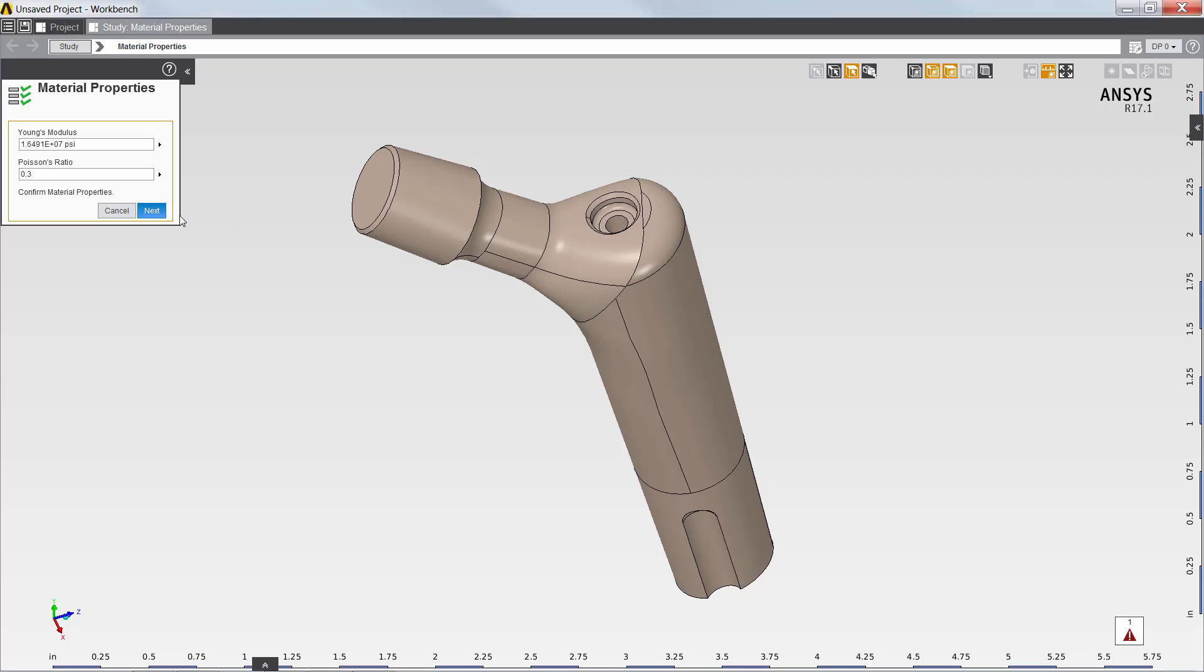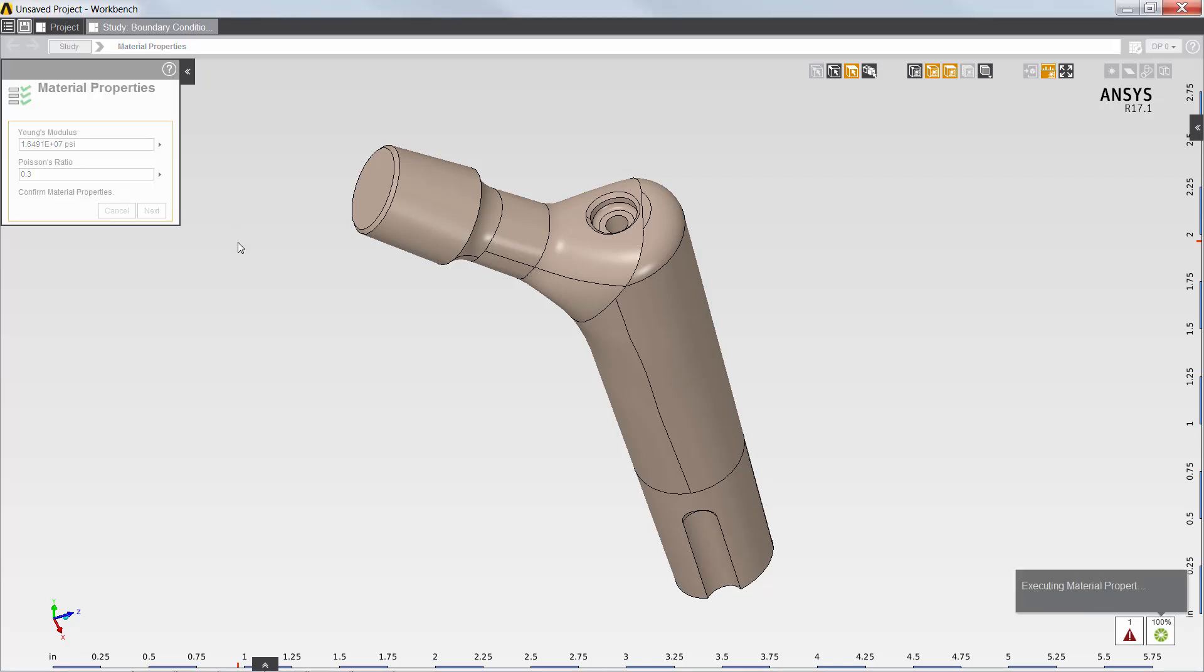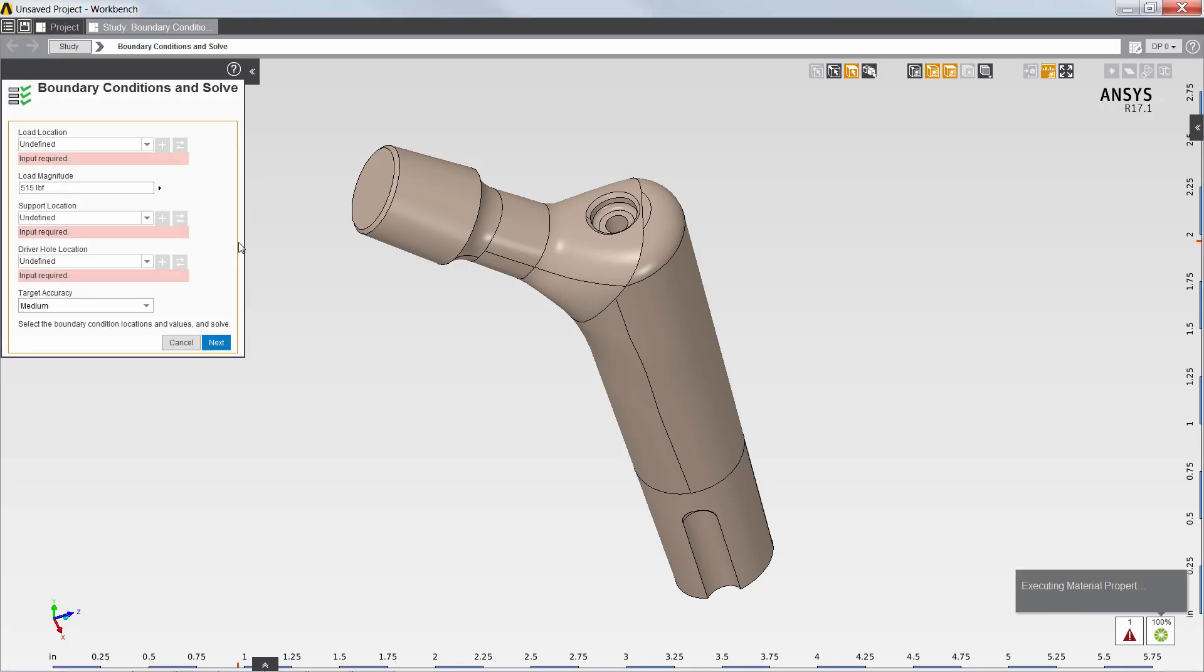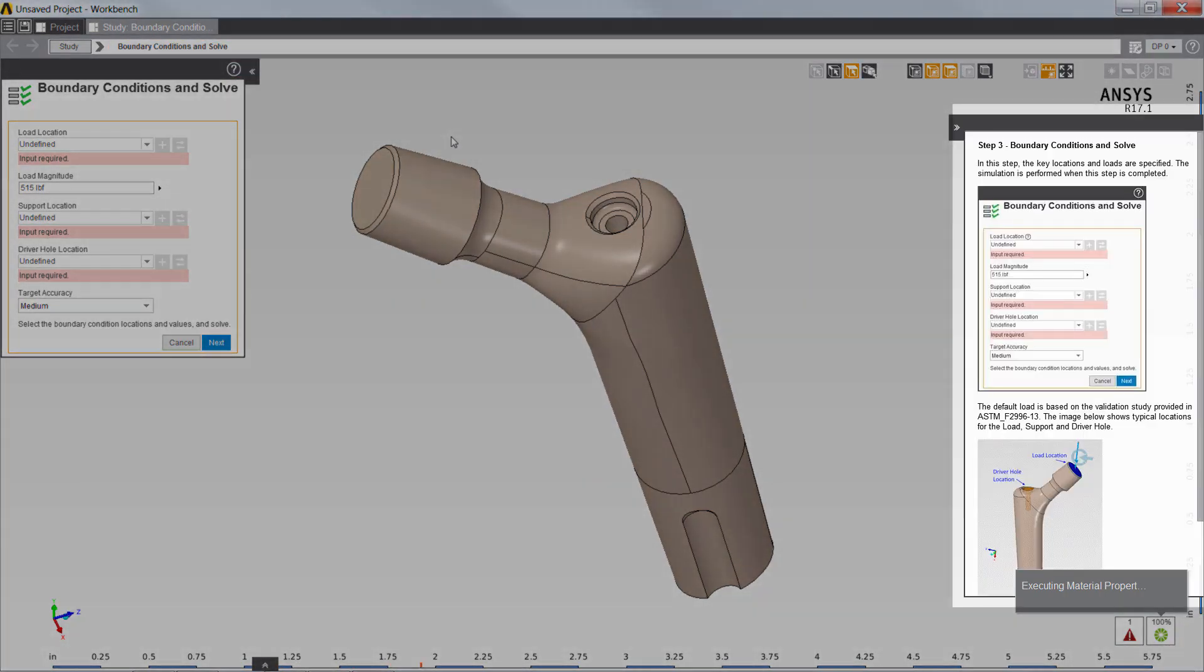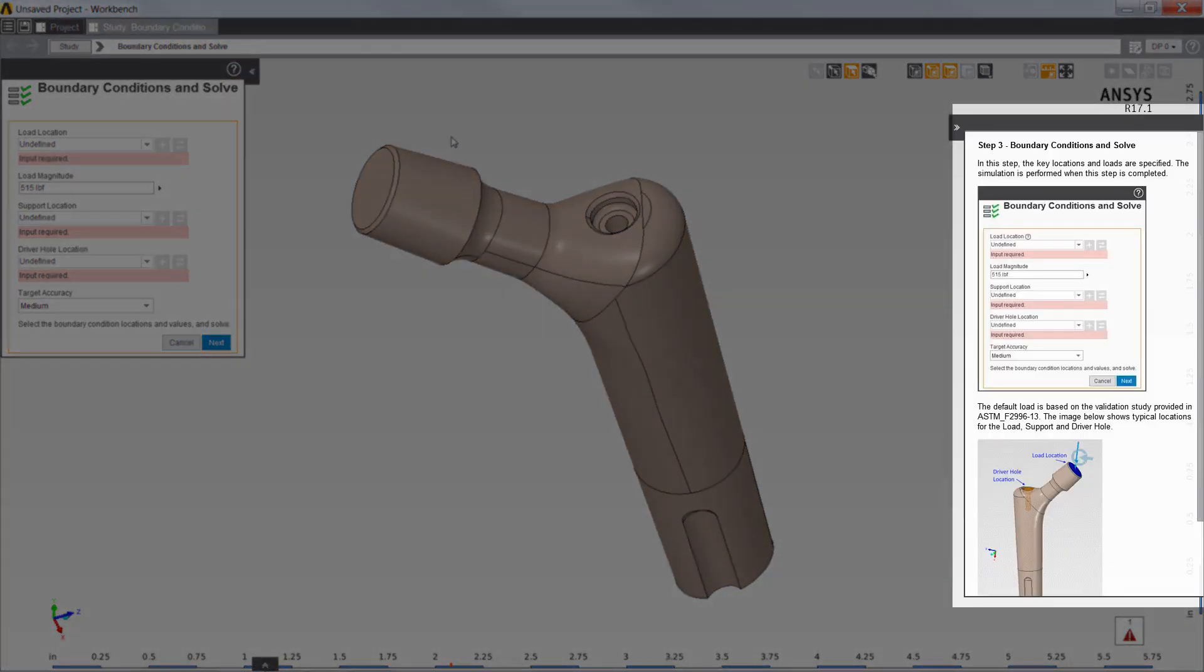Next, I'll define the boundary conditions for the simulation. Note that the app includes customized context help to guide users of the app who may not be experts in simulation.